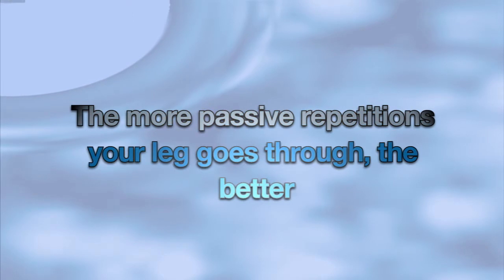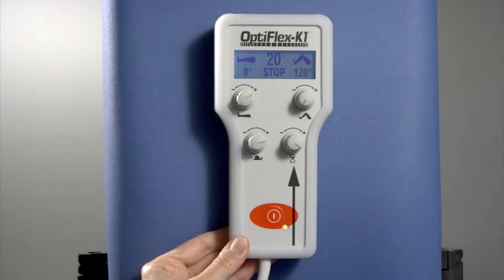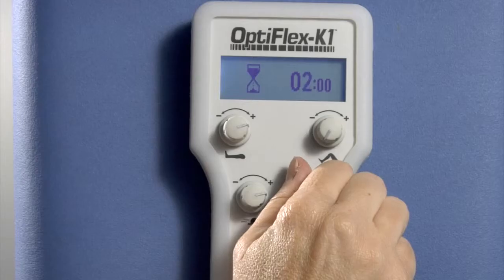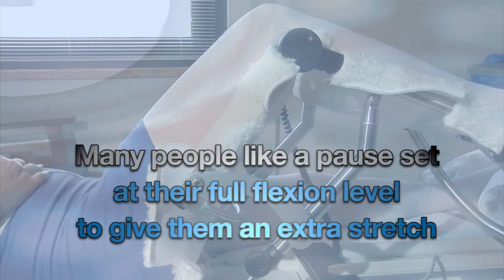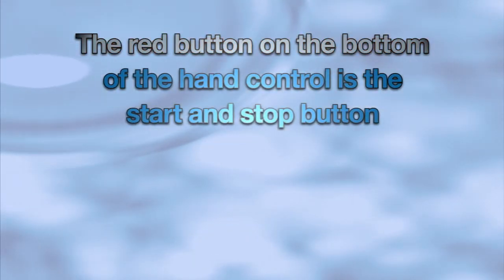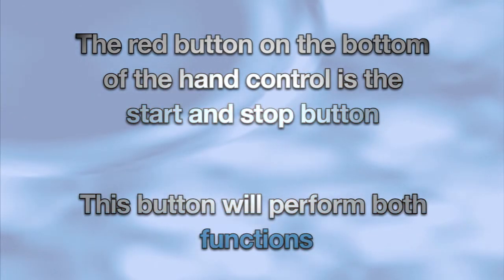Remember, the more passive repetitions the knee goes through, the better. To set the pause time, use the knob symbolized by the picture of an hourglass. Push the pause knob in and turn in the appropriate direction. The pause will run anywhere from 0 seconds to 59 seconds. Many patients like to set a pause time at full flexion to give them a little extra stretch. The red button on the bottom of the hand control is the start and stop button. This button will perform both the stop and start functions.